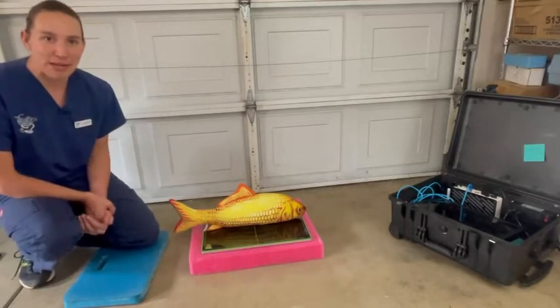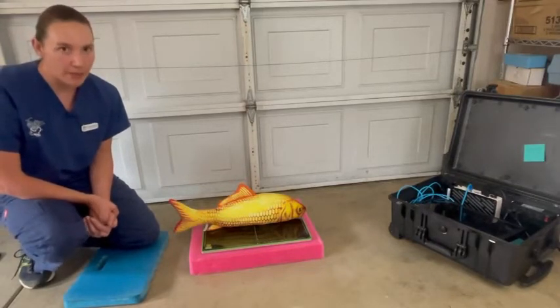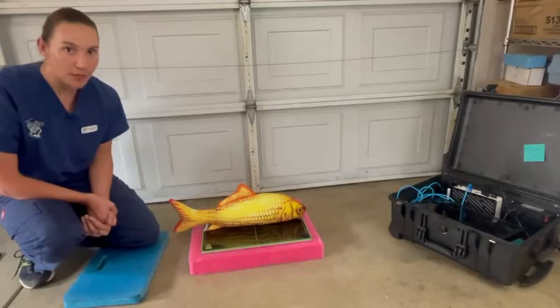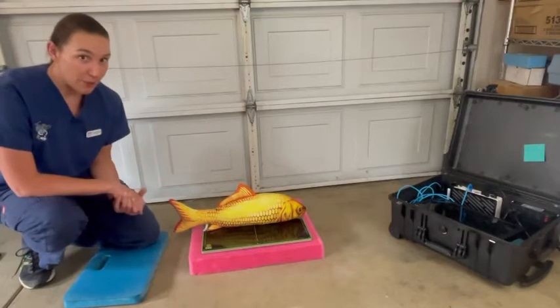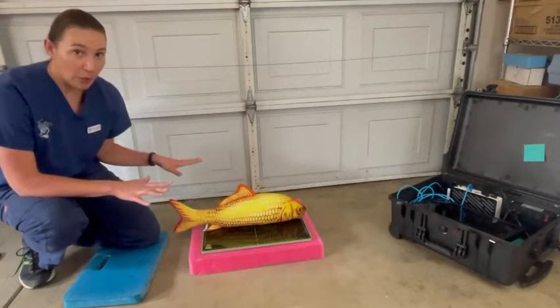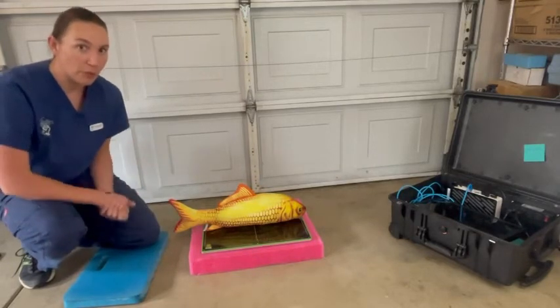I apologize that we have not been able to post any videos lately — we've been insanely busy on the road. So we are now coming from the very exotic location of my garage, because we need to be able to show you today how we take radiographs on fish. For this demonstration, we're obviously using fake fish and none of our equipment is plugged in, but I'm going to go ahead and pretend to get ready.